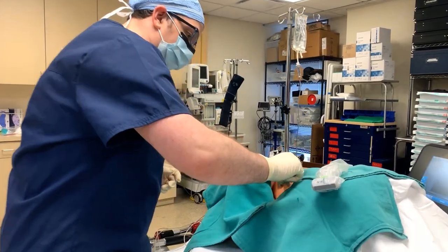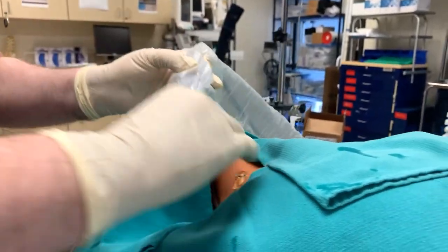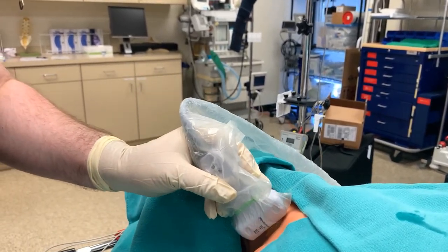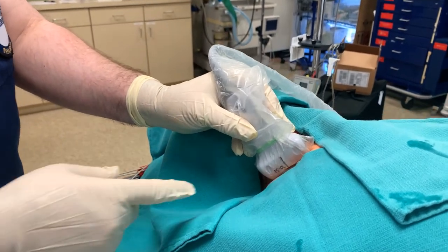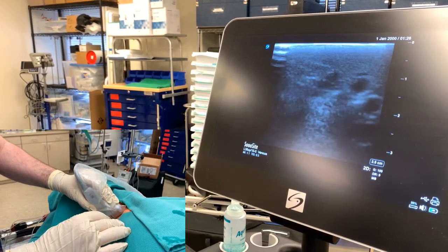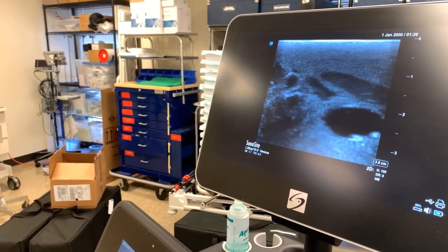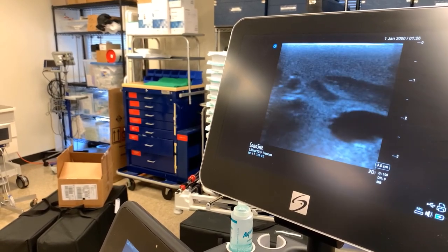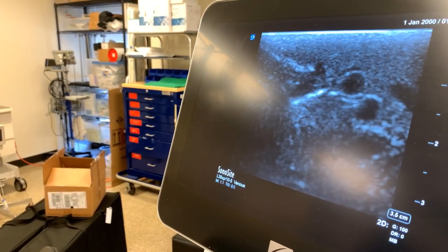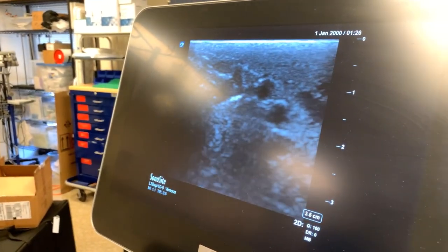We are going to place a little bit of gel here on the patient — we should still have some on the inside of our probe cover as well. I'm going to palpate the clavicle and place my probe. I need to make sure that the left side of the screen is going to be the side closer to me, so when I insert the needle, it should be coming in from the left side of the screen. I'm walking my way up looking for landmarks, and I can see my nerve roots. I'm going to identify the blood vessels — we want to avoid those. There's the artery a little bit off screen and the vein. My target is to the right side of the screen at about one to two and a half centimeters depth — that slanted traffic light appearance represents my cervical nerve roots, and that's my target for the interscalene block.